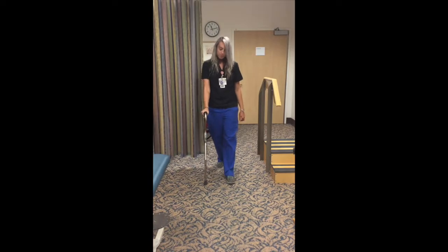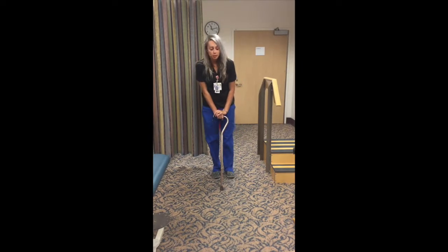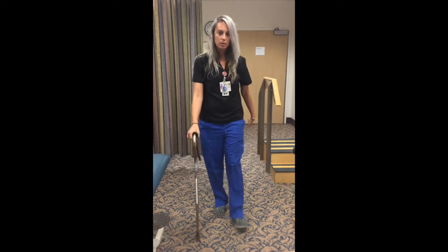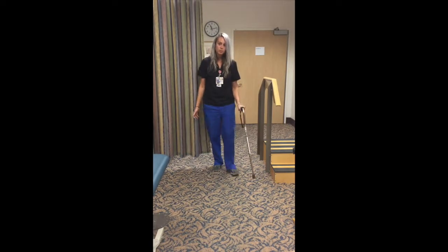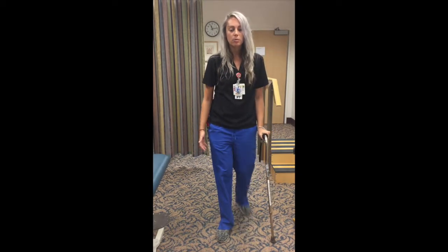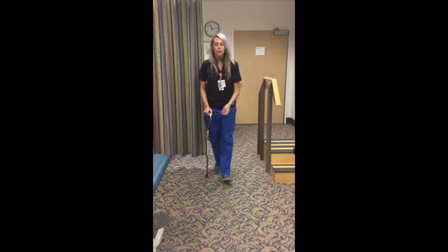Okay? Christy, can I ask you? Everybody knows it's counterintuitive. Why do we put it on the opposite side? So, natural human anatomical walking is opposite arm, opposite leg. If you're putting the cane in your other hand in order to lean on it, you're actually then walking completely wrong. Our bodies were not designed to walk like this. So we're promoting correct anatomical alignment.